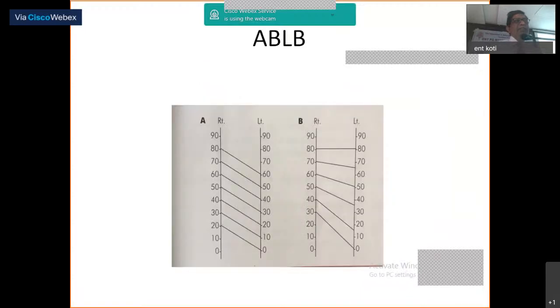When you take this, this is called a ladder gram, in which in A, the left ear is normal, the right ear has got a hearing loss of 20 decibels. As you increase the sound by 10 decibels on the left side, the normal side, it corresponds the same way to the right ear. So there is a non-recruiting hearing loss.